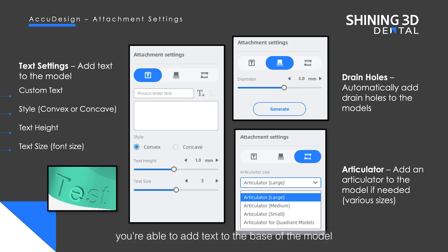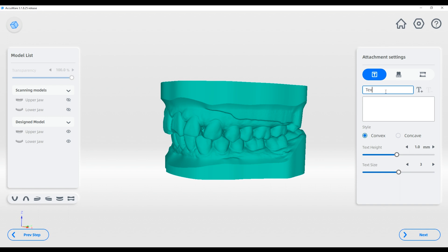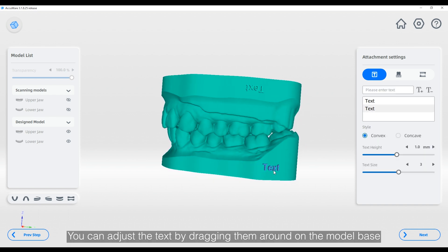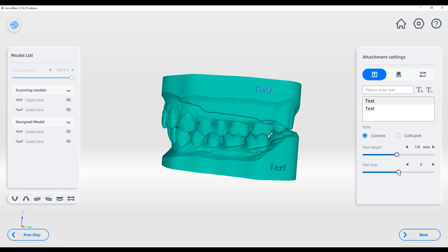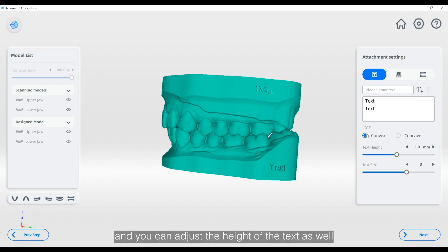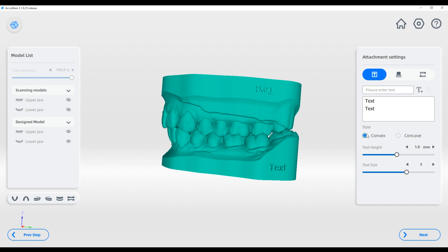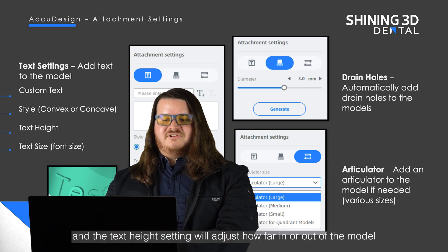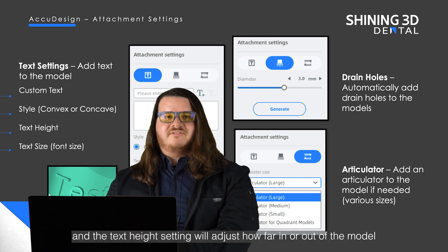On the attachment settings page you are able to add text to the base of the model. You can adjust the text by dragging it around on the model base. You can increase the text size using the slider on the right, and you can adjust the height of the text as well. The text can either be convex or concave, and the text height setting will adjust how far in or out of the model it extrudes or intrudes.